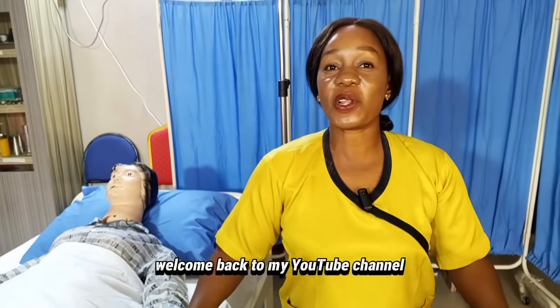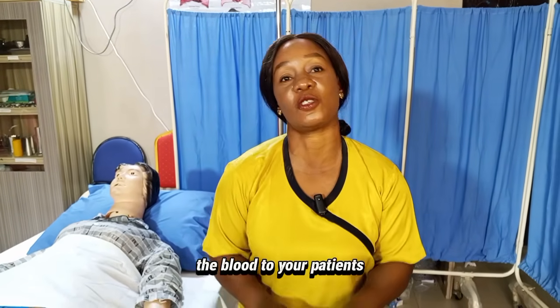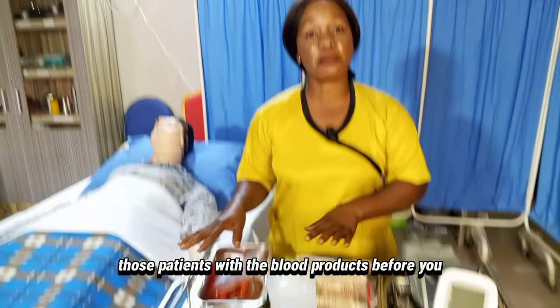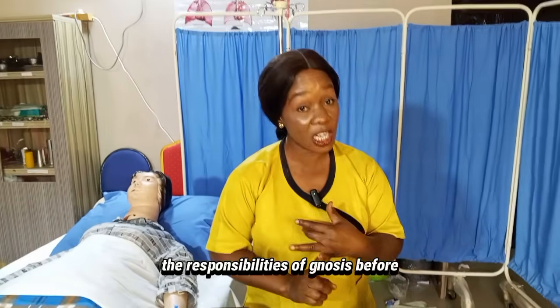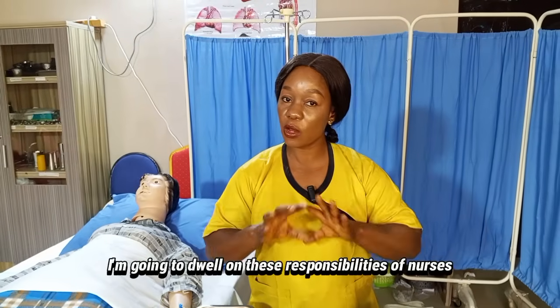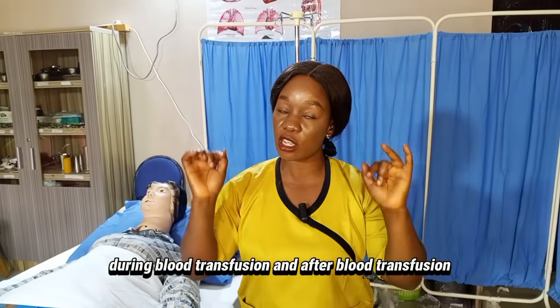Hello Nurses and Future Nurses, welcome back to my YouTube channel. On today's episode of Nurse Clements B, I am going to teach you how to transfuse blood to your patients. In this video, I am going to use a checklist covering the responsibilities of nurses before, during, and after blood transfusion.